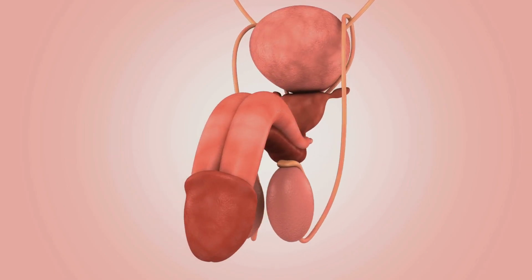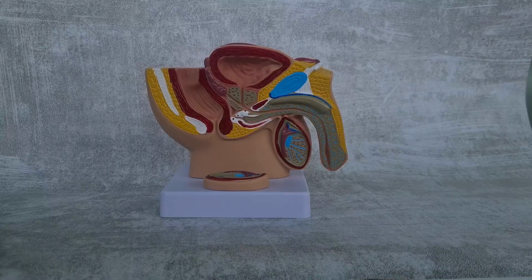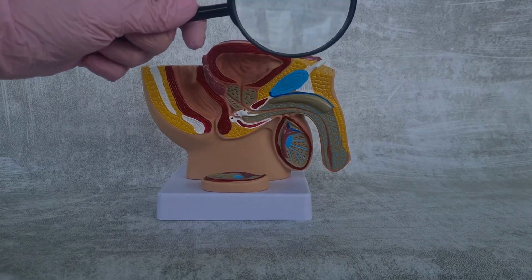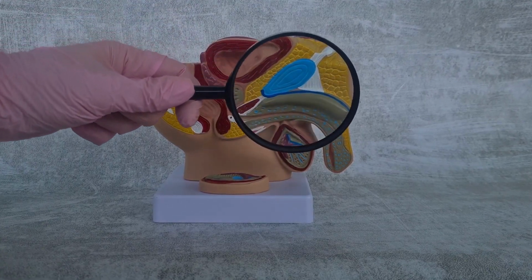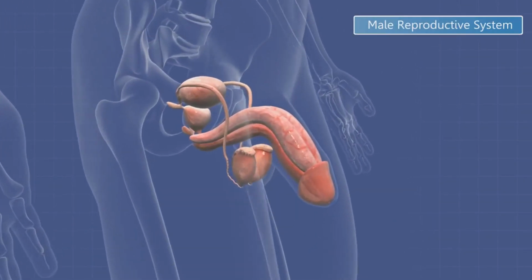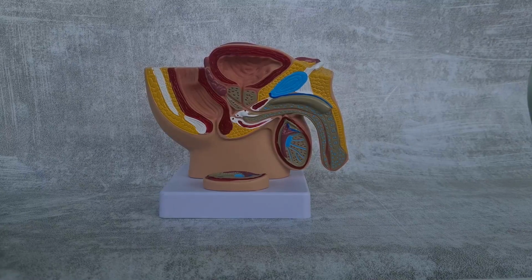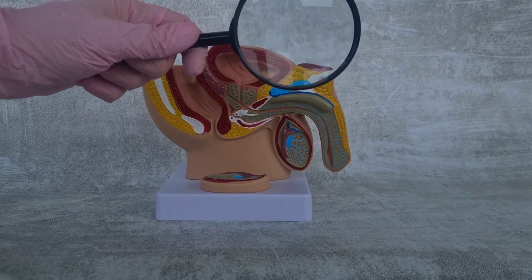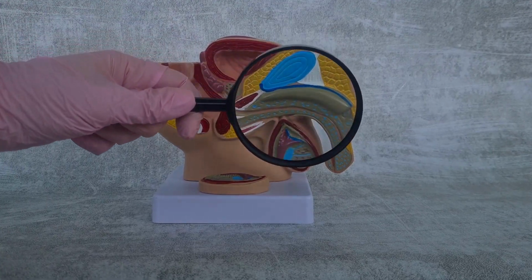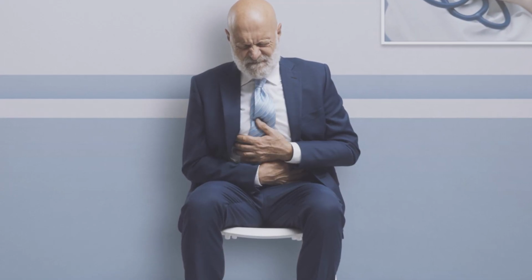Autoinflation is expected during the first 6 weeks after surgery. Due to swelling and inflammation, extra pressure is generated around the reservoir, and partial erection can happen. Most of the time, it does not need any exceptional management. Your penis will go back to its normal shape and appearance 3 months after surgery. In the first 6 weeks, there will be swelling, bruises, and inflammation, and it can take up to 3 months to return to a normal appearance in the genital area.